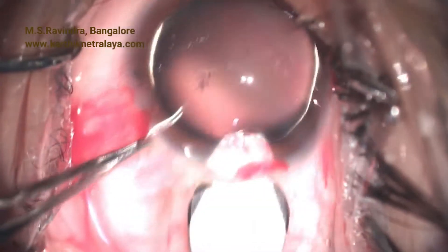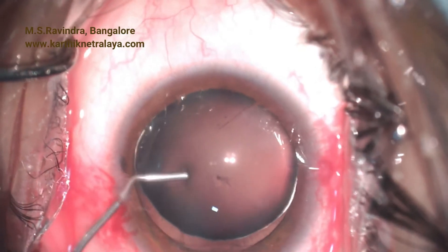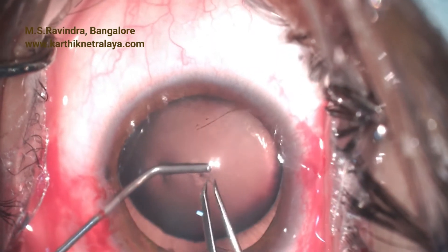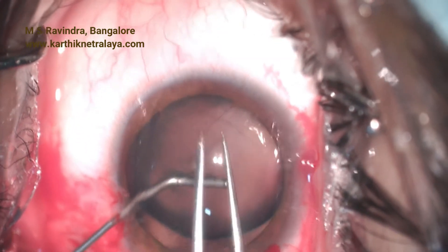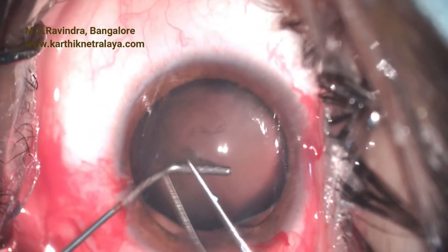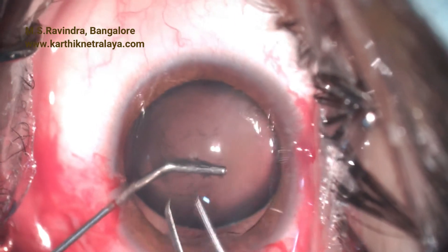The two centripetal forces applied by sharp instruments will nullify the zonular weakness that we have here. The tunnel is enlarged with a blunt keratome to 5.2 millimeters, and the aperture in the capsule was held by a 27-gauge cannula.